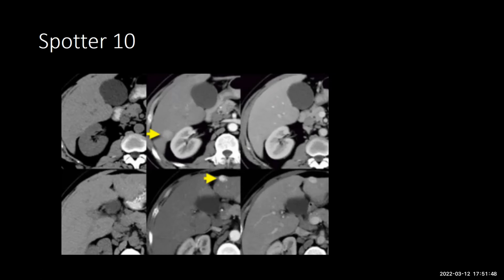So in final, can you tell something about the LI-RADS classification? LI-RADS classification is used to characterize the lesions in cirrhotic patients, and also chronic hepatitis B patients who are not cirrhotic. In background cirrhosis and chronic hepatitis B, they are more at risk to develop HCCs. So if we find any lesion in these patients, we have to follow LI-RADS criteria.